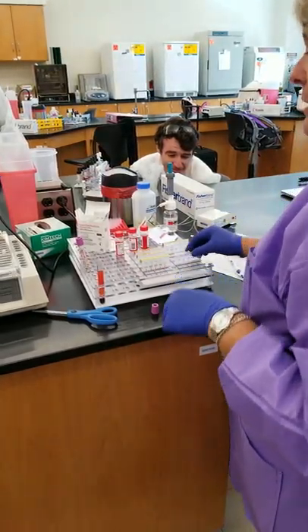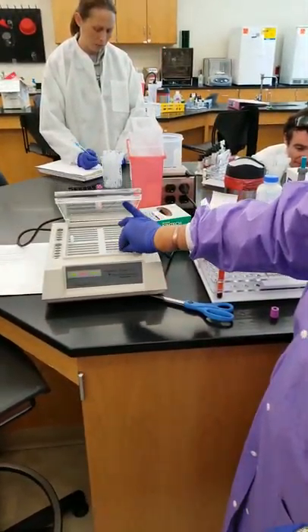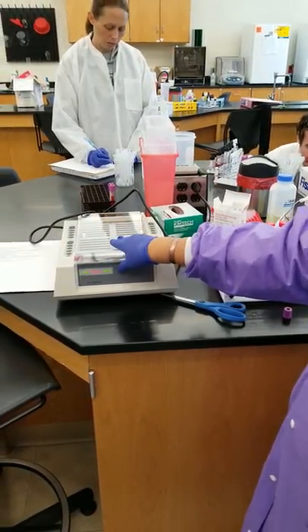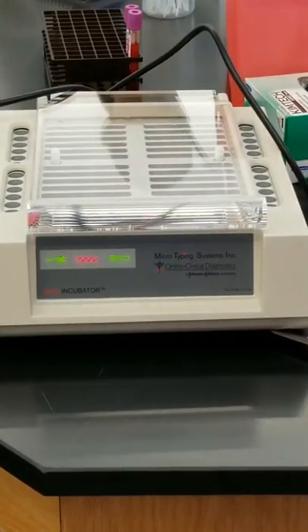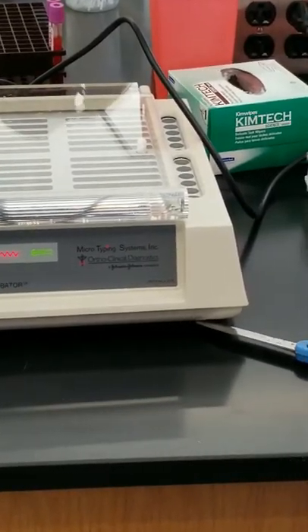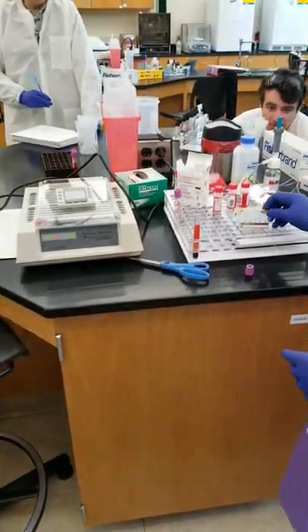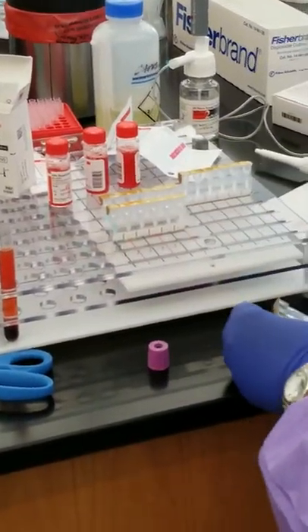Then I'm going to take my gel card and I'm going to incubate it in this heat block, which is 37 degrees. It should be 35 to 39. And it's going to go for 15 minutes. Okay. So in the meantime, while that's going, we're going to do Eve's blood type.